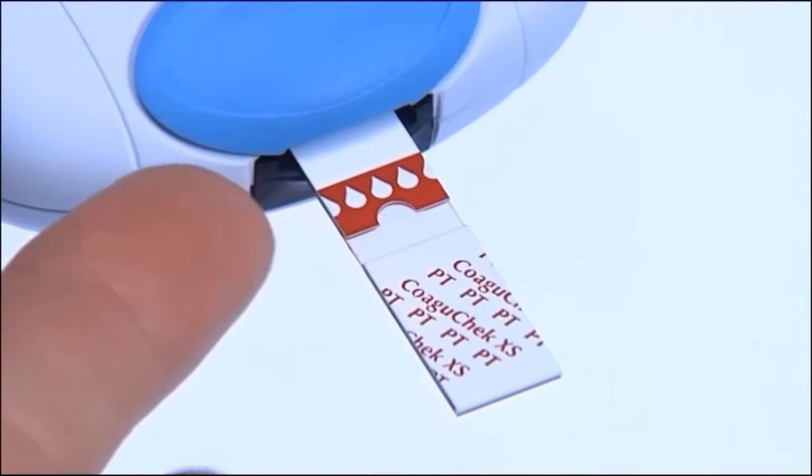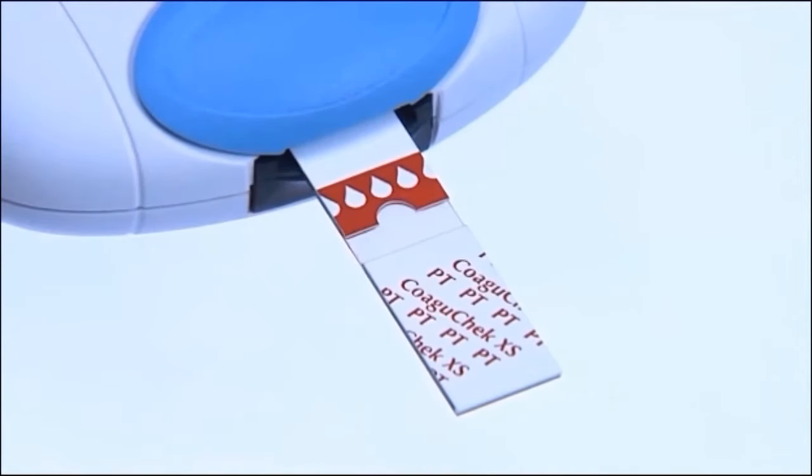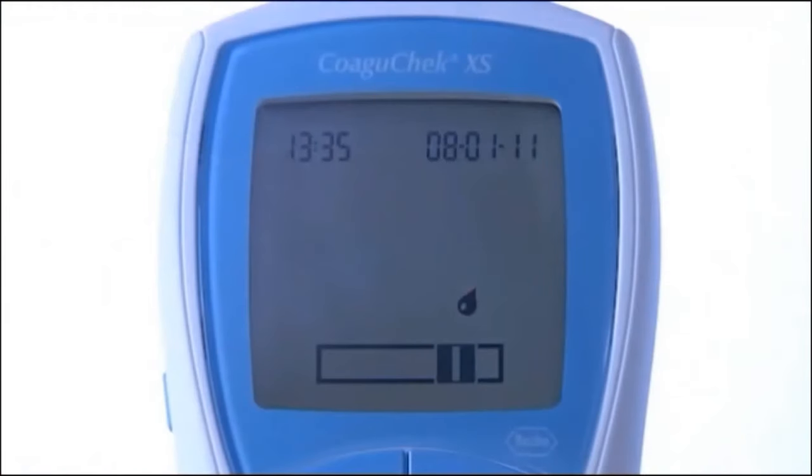The test strip draws up the blood by capillary action. During this process, it is important to hold the blood drop to the test strip until the flashing symbol has disappeared and the meter beeps.